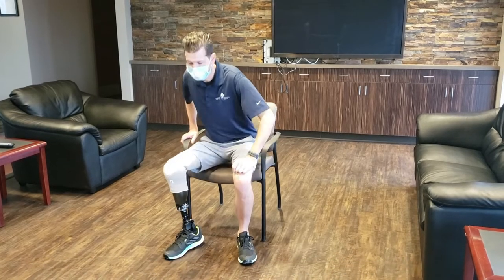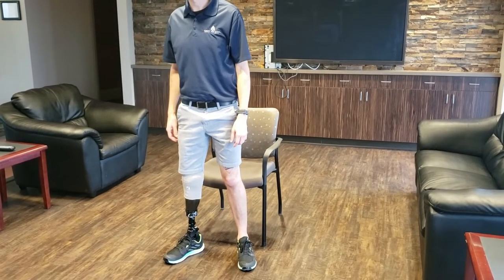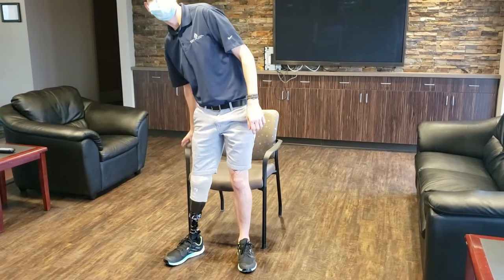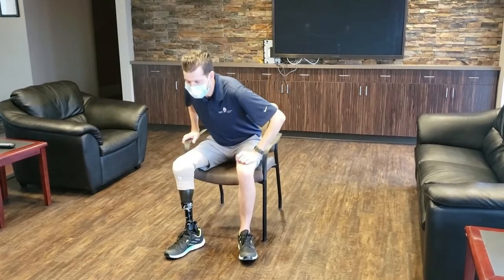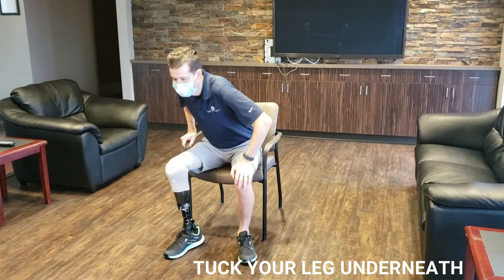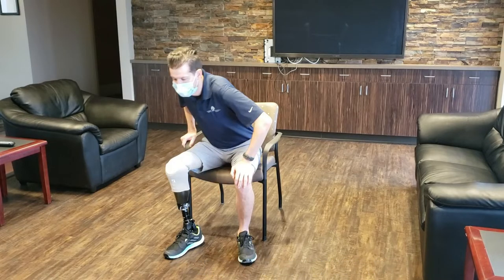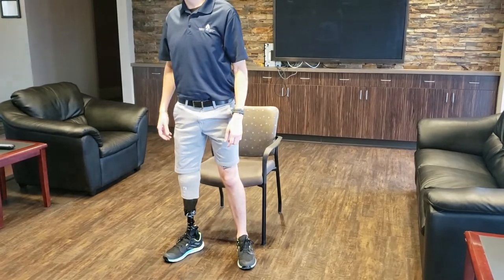Foot placement is also important here. You'll see that Mark keeps his feet kind of wide apart. You might also find that you can't bend the knee on your prosthetic side as much as you normally would because of the way that the prosthesis fits. So you will do better if you tuck your other leg under you so that you can use that foot for a little bit more leverage.